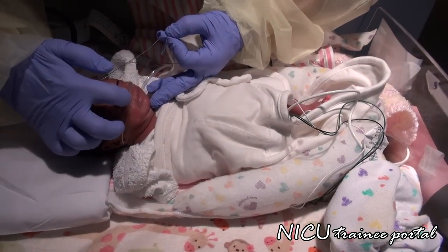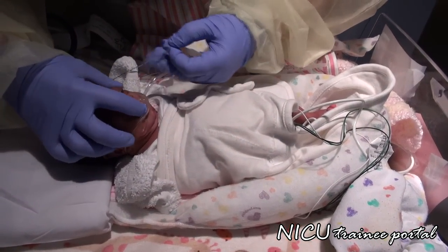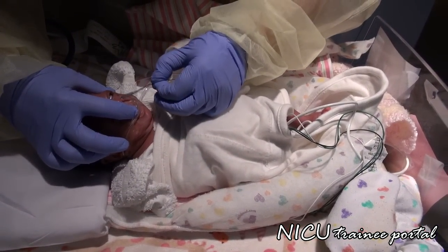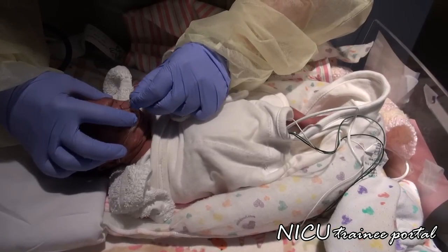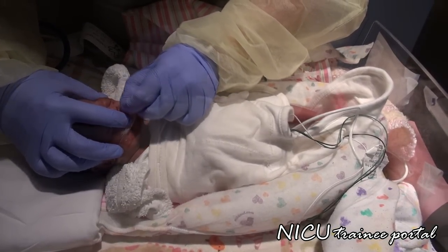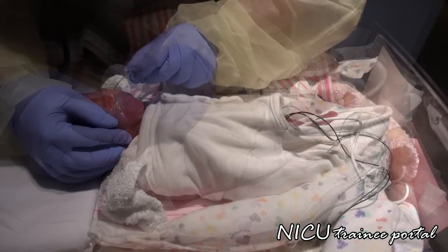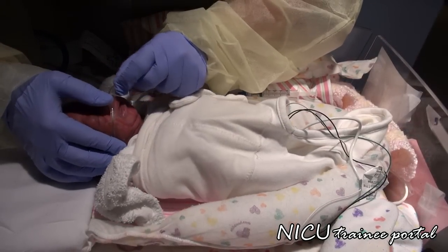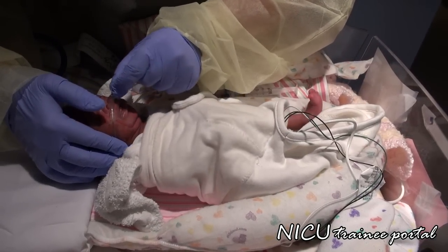The infant is monitored throughout the procedure for respiratory distress or bradycardia. You should not push against any resistance, and you should stop the procedure at any time if there is coughing, gagging, apnea, bradycardia, respiratory distress, or cyanosis.